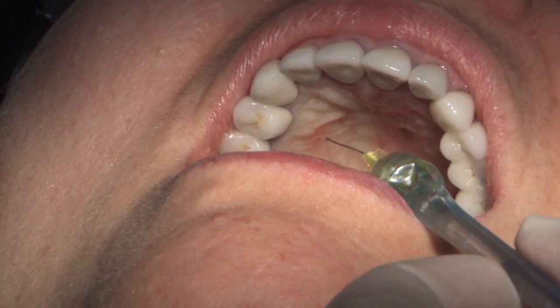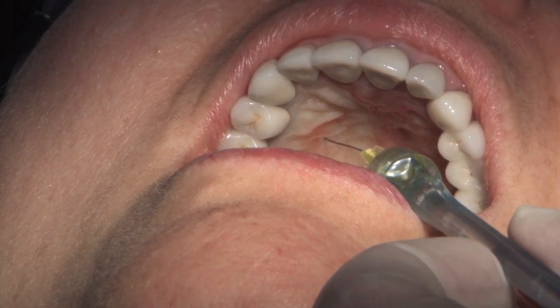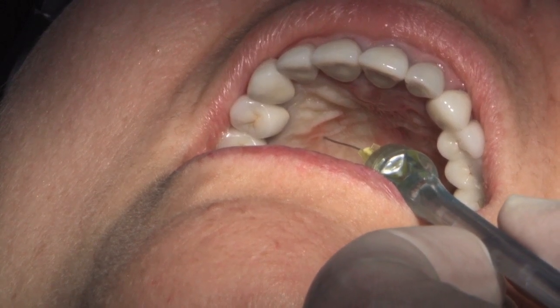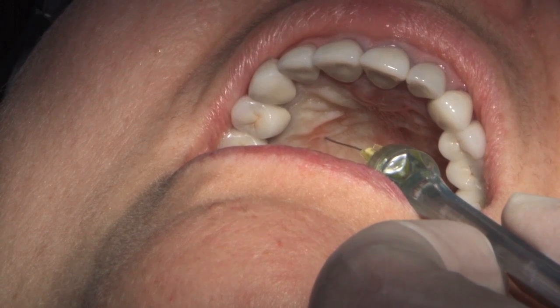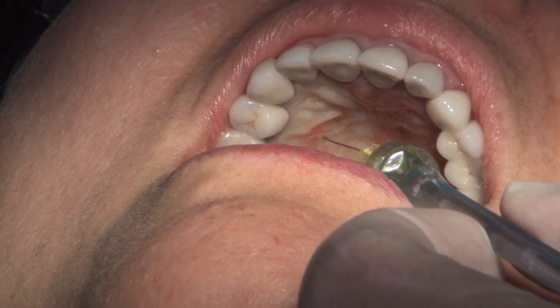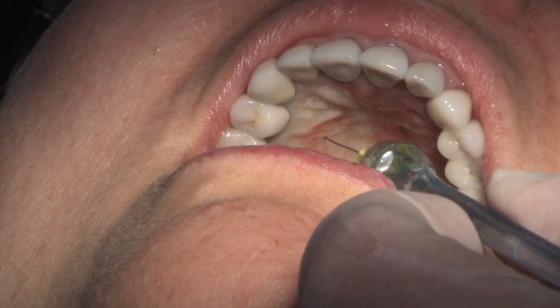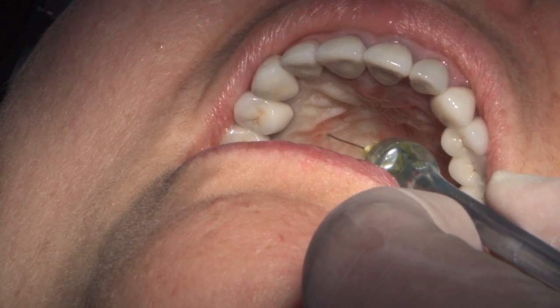As you retract the tissue back, we'll see this blanching diffusing through into the buccal structures. For some individuals, we'll see the same blanching on the buccal tissues at the end of this injection. That's a phenomenon where we're getting lingual gingiva, pulpal structures, and facial gingiva — without getting any labial anesthesia.